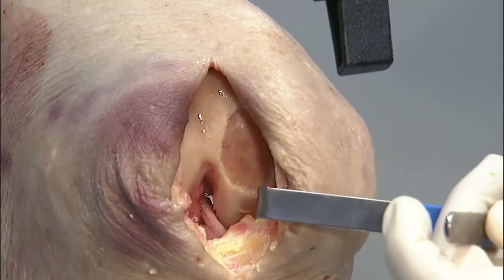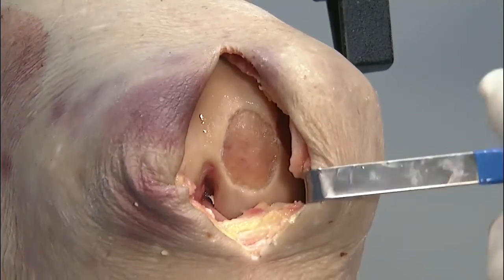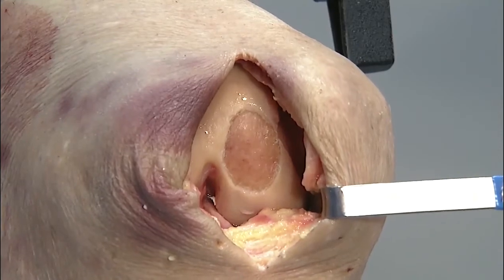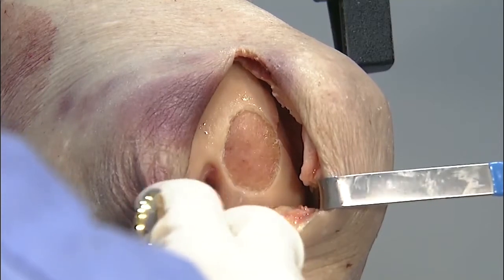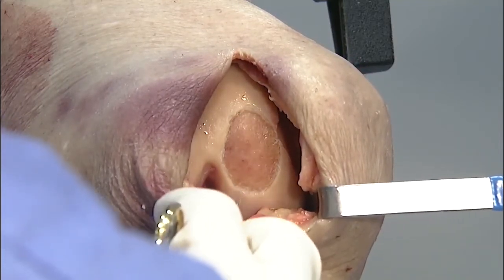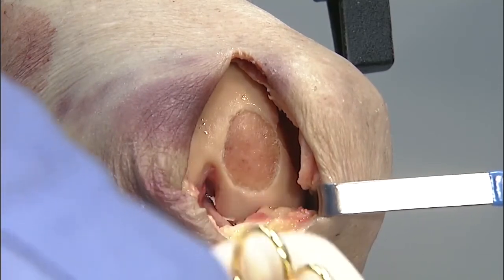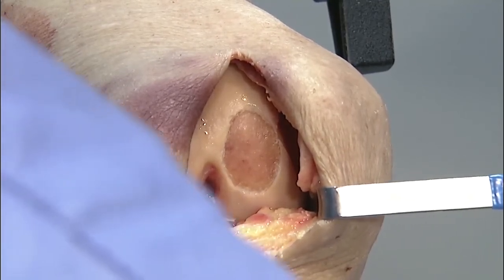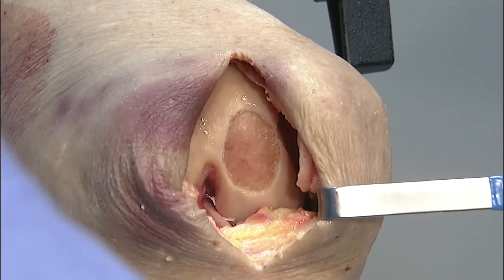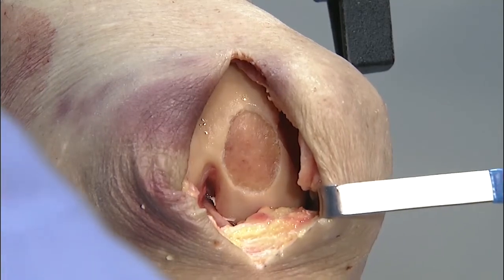I know that this can apply to multiple cell-based technologies, but what about where you stop debridement, and how far do you go into cartilage that is soft but visibly looks okay? Yeah, that's a great question, and I think it's a huge advantage for ACI or MACI because the theory is, if you have a sized implant, so let's say you have a 2 centimeter disc or something like that, or even when we're doing osteochondral autograft transfer, I think the tendency is to make the lesion smaller than it should be because you're trying to make that area smaller for your implant to fit it.